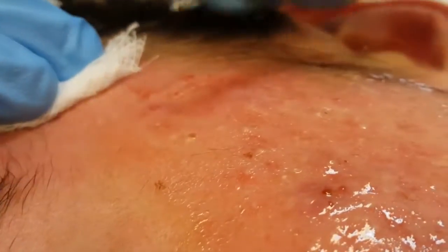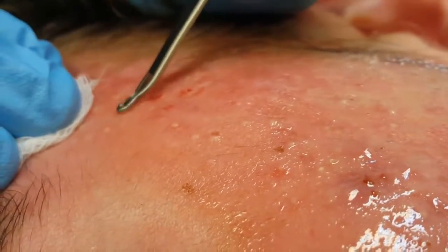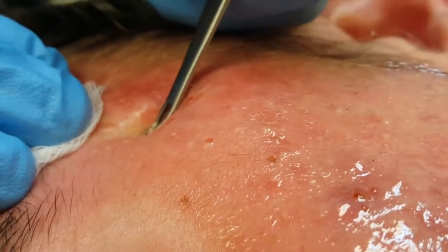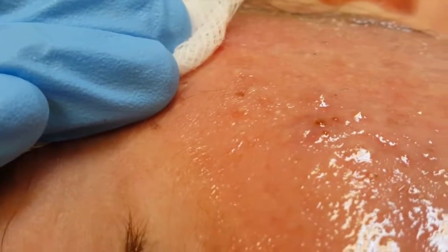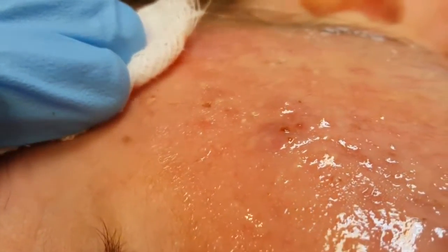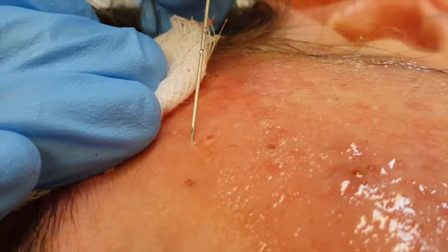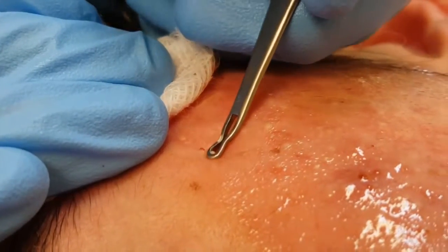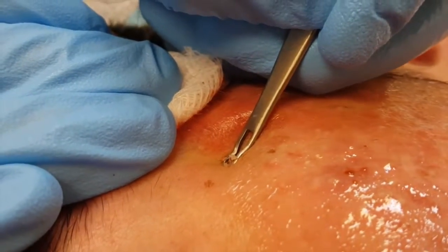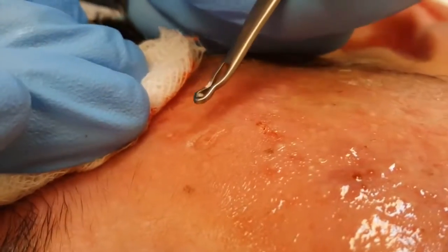And it's a very patient process of extracting the cysts. We find it's really relaxing actually doing that. Doing a whole laser list the whole day and you're extracting these cysts, it's therapeutic, seriously. So see how fine we penetrate those. It's just a little nick. We try not to get bleeding. And with that little nick you can get the contents out. And the patient's totally painless because of the gel.